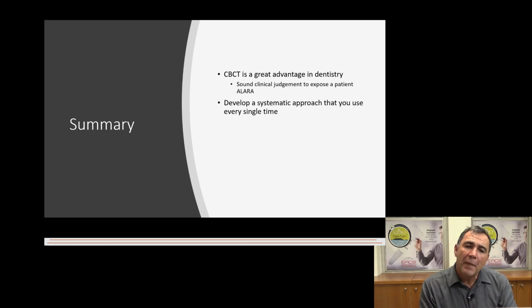Develop a systematic approach that you use with each and every case. If you do not have a systematic approach, you get lost and you lose sight of the bigger image, and you can miss pathologies that could easily have been seen.